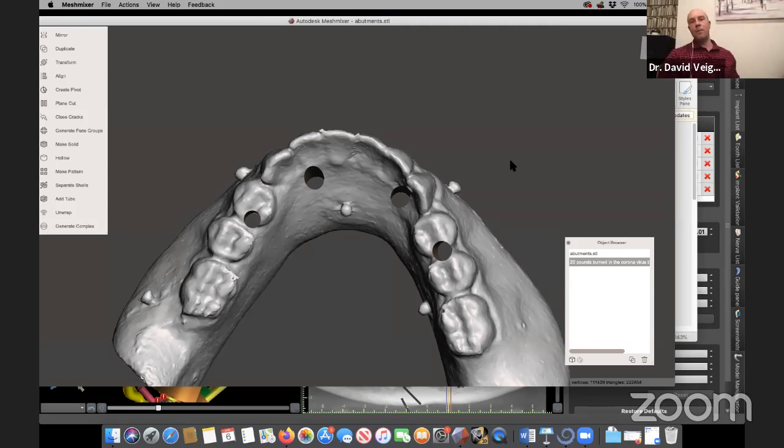Okay, so basically you're asking, is it a good idea to reline the prosthesis with some type of radiographic material? My answer would be no, because what we want to do is, yes, reline the prosthesis, but the radiographic material needs to be in the beads, not in the palatal bit, because we need specific spots to pick, not a whole palate.